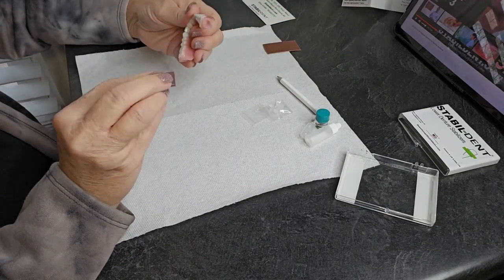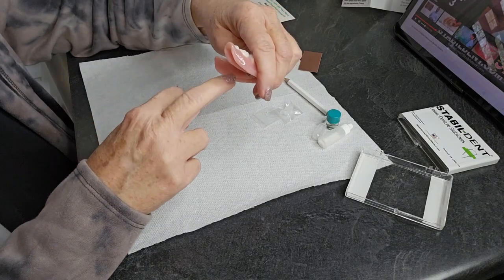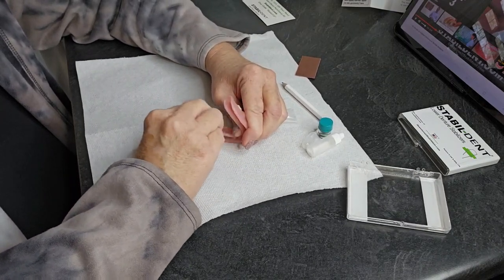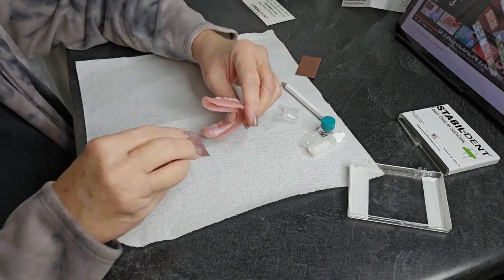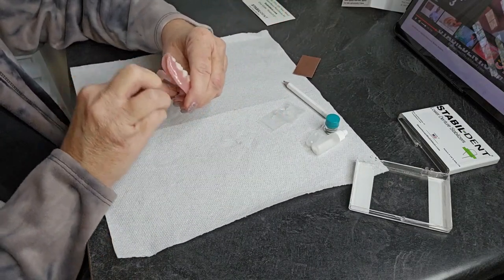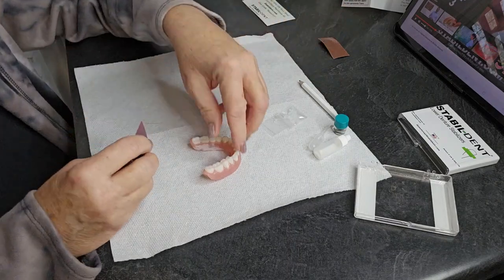It says to start by sanding the lower denture area right in through here with the coarse sandpaper, then follow it up with the fine sandpaper. We want to make a surface that this is going to stick to. That's our plan.